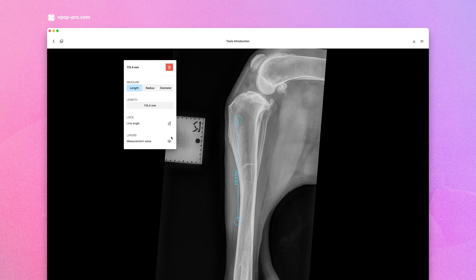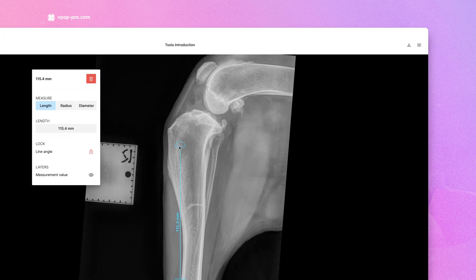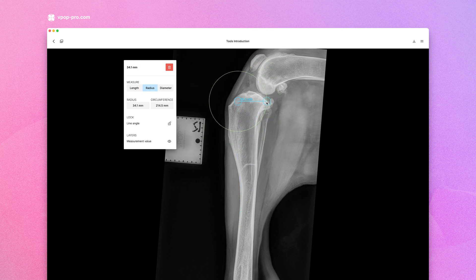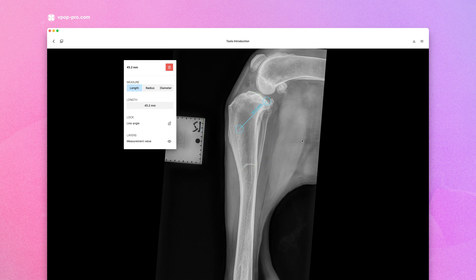You can toggle the measurement value off if helpful, and lock the line axis to avoid any inadvertent movement. To superimpose a circle, select Radius and move to meet the circumference of your anatomical landmark.